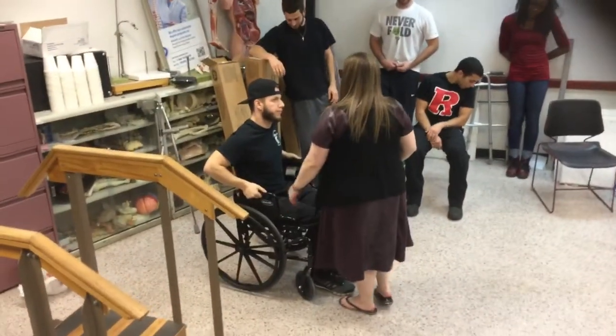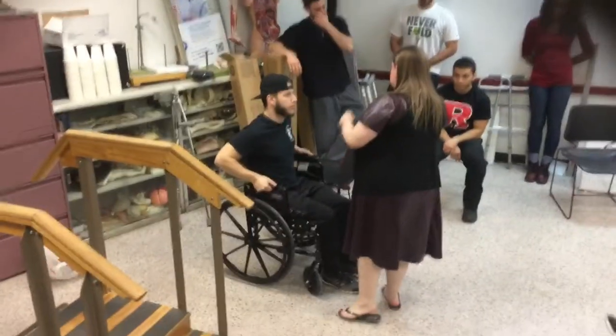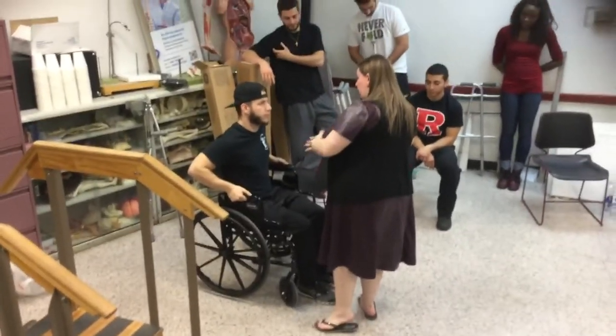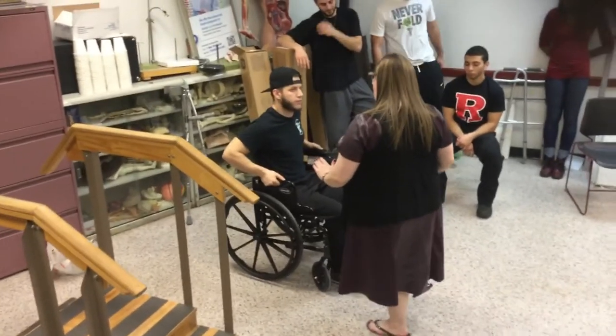So now we're going to do non-weight bearing. Non-weight bearing right leg. You are non-weight bearing right leg, which means zero. Absolutely no weight goes on that leg. That leg cannot touch the floor — you're going to have to keep it up like this.